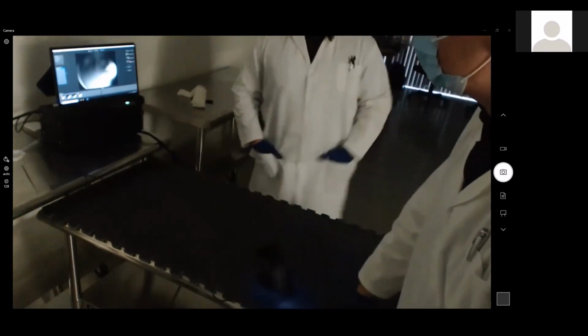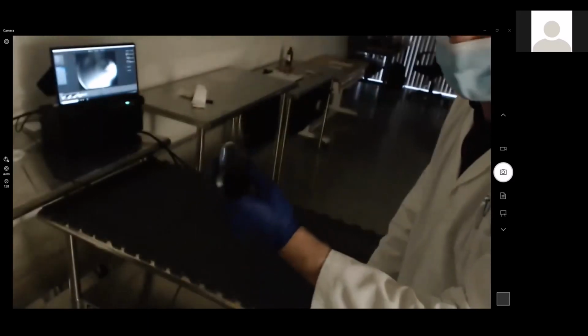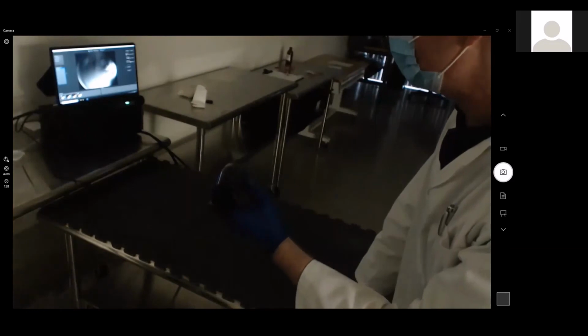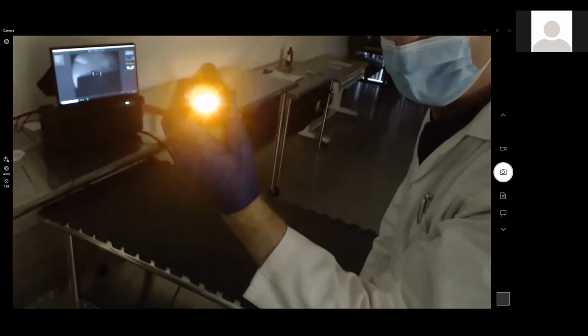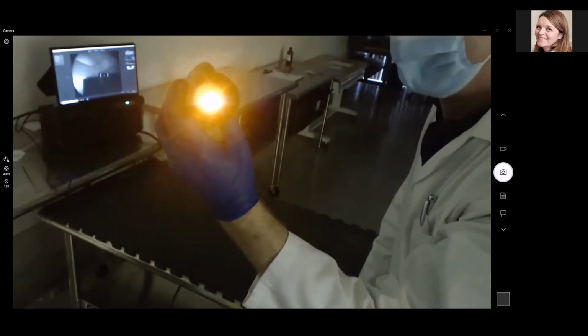Can you turn the light on for a second? Back on here? Or no. I'm sorry, Trenton. No, this light here on the epicam. Yes, I got it. Sorry, I'm general light. Start it again here. Where did that go? Do you see that light? Yeah, it's too bright. Yeah, it's very bright.